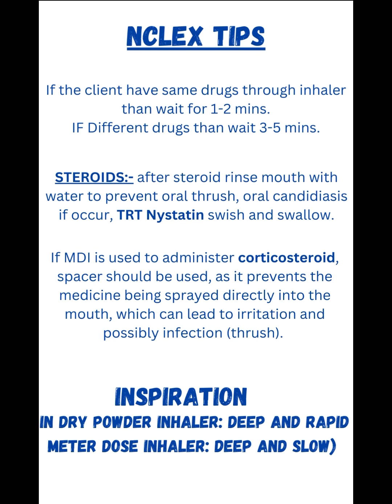For steroids, after steroid use through the inhaler, we ask the client to rinse the mouth with water to prevent oral thrush and oral candidiasis. And if it occurs, then it has to be treated with nystatin swish and swallow. If a metered dose inhaler is used to administer a corticosteroid, then we have to use a spacer with it, because it prevents the medicine from being sprayed directly into the mouth, which can lead to irritation and possible infections such as oral thrush.